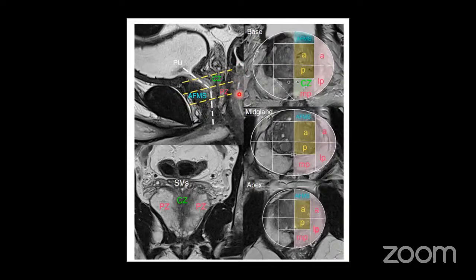It's a good practice that once you start reading your MR on axial T2s, which is the important sequence, specifically for the transition zone, the next thing is to compare the same lesion on the next plane, that is the coronal plane, and sagittal will help you localize whether it is base, mid-gland, or apical level.